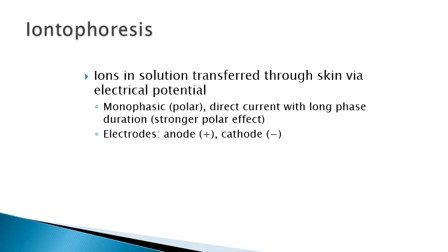So in other words, if you're using a negatively charged medication, you have to put that on the cathode, the negatively charged pad, because that's what's going to help drive it through the skin, because like repels like with the charges. You have to check with your state practice act since you're administering a medication. Look at your state practice act and how that would be regulated.